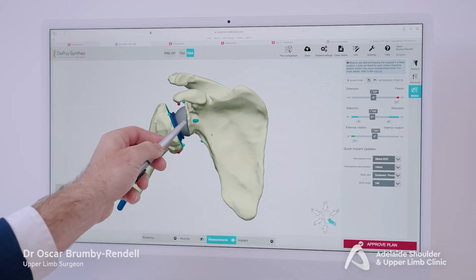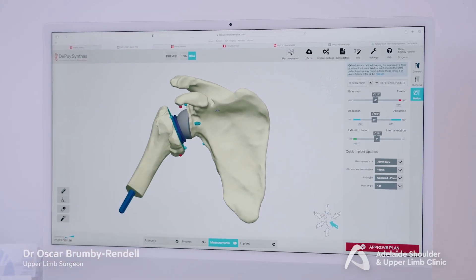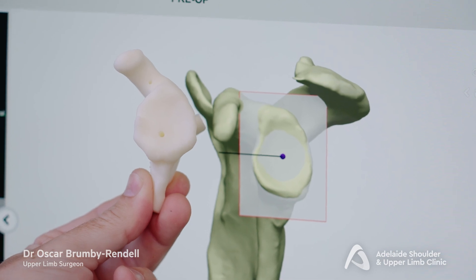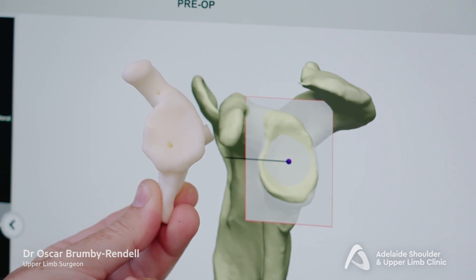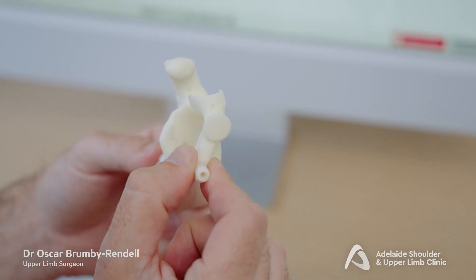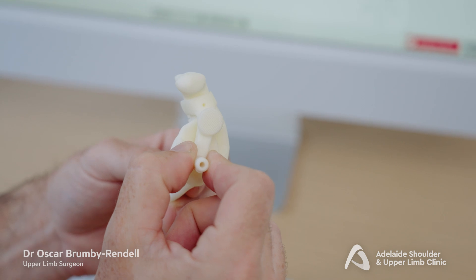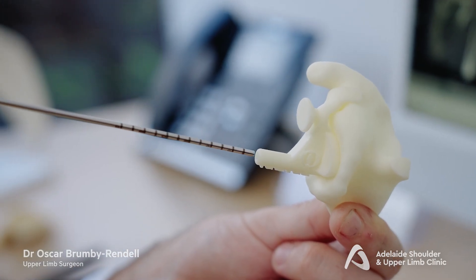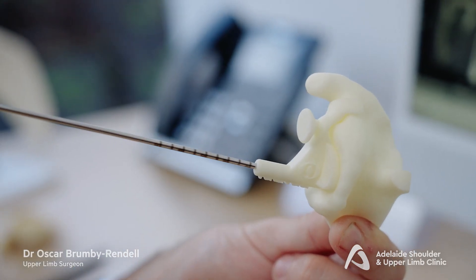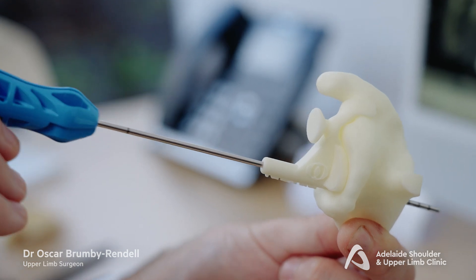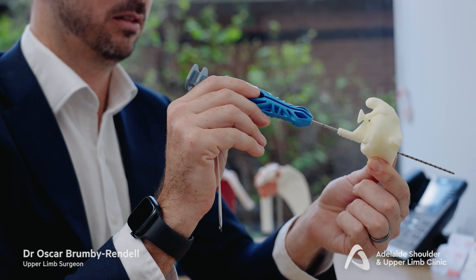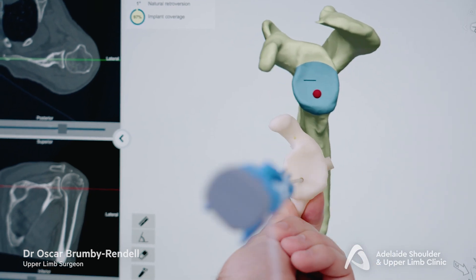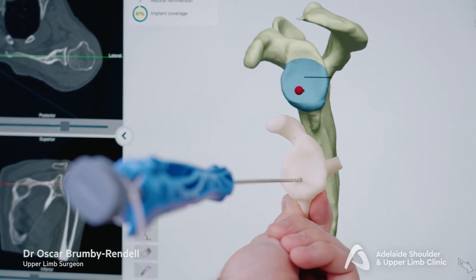Once both the glenoid and humerus are locked in and saved, we can then request specialised 3D printed plastic jigs that are patient specific. This little jig is made specifically for the patient's anatomy and clips on to the glenoid with the predetermined trajectory for us to insert the guide pin. This guide pin then sets the implant to be in the position which we know from our templating is the best possible spot for this patient.